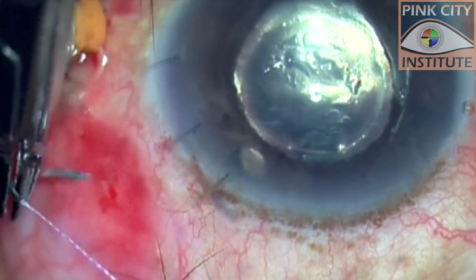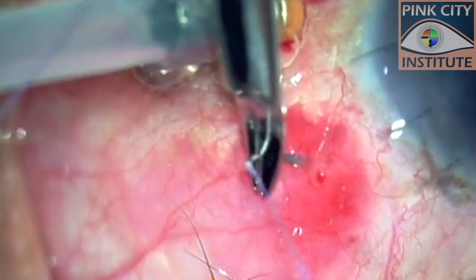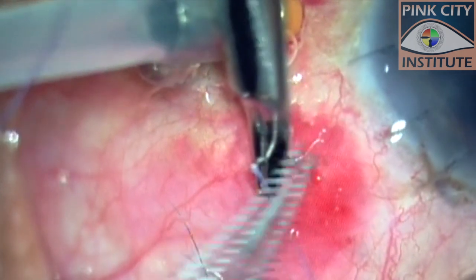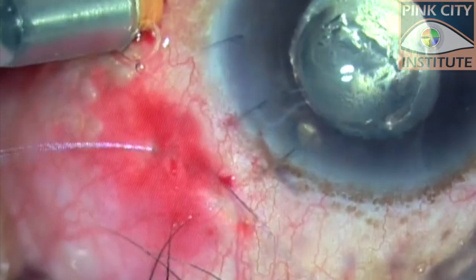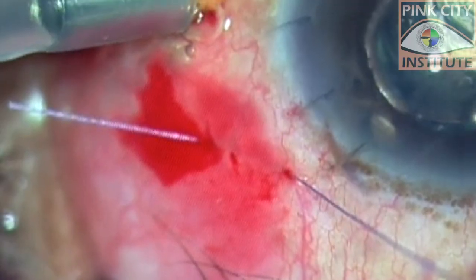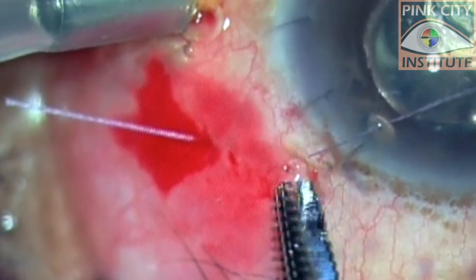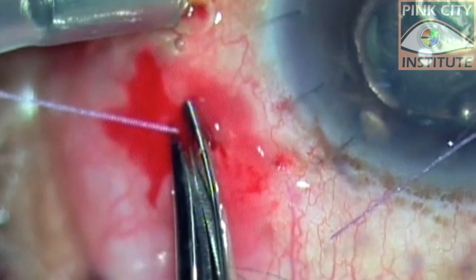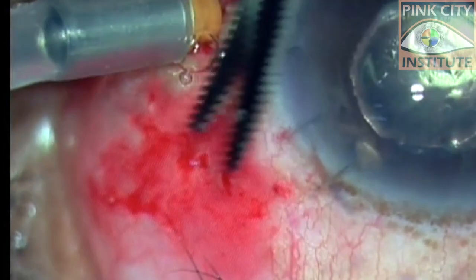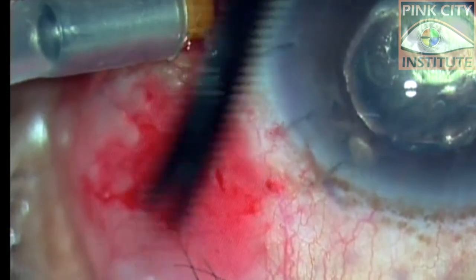The 7-0 polyglactin suture was passed transconjunctivally, perpendicular to the sclerotomy. The sclerotomy leak stopped and we did not feel the need to tie the suture. Both ends of the suture were trimmed and subsequently slipped into the subconjunctival space.